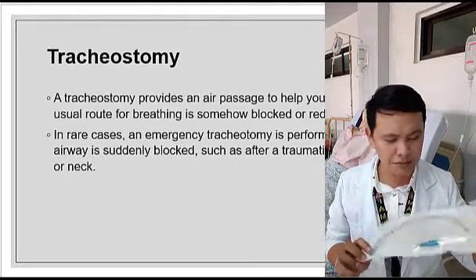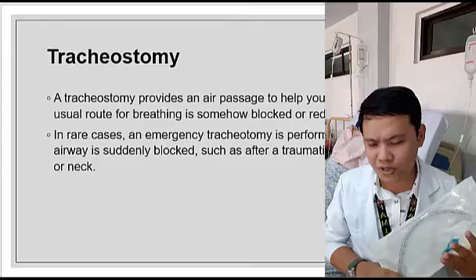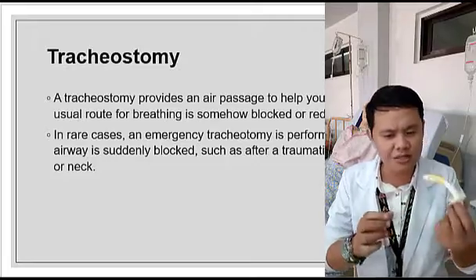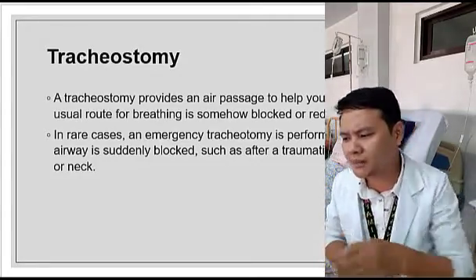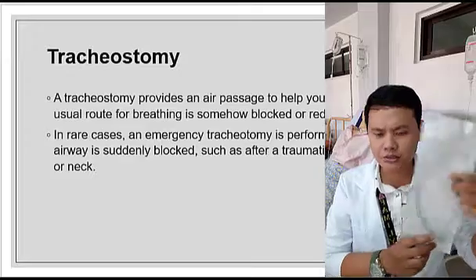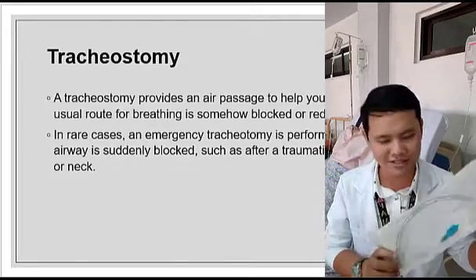Okay? But for some cases, hindi ET tube ang ginagamit natin, especially for long-term use of the ventilator. Ang ginagamit na ng iba, well, actually, it depends on the doctor, is the tracheostomy. Pang long-term po ito. Pero kung short-term lang naman, ang pagde-deliver ng oxygen, ang paggamit ng ventilator, the endotracheal tube will be enough. Don't worry guys, kasi pag-aaralan din natin ito in our next topic.